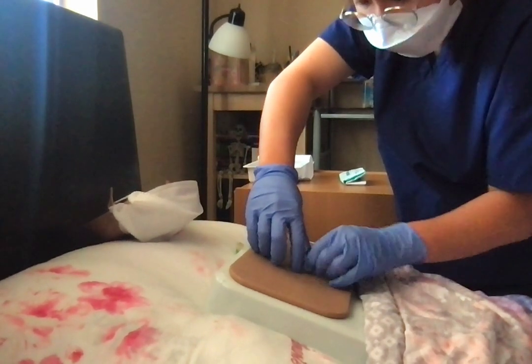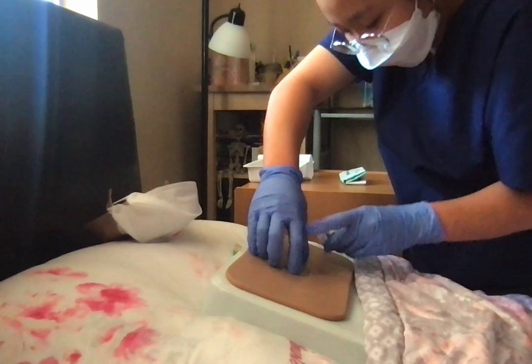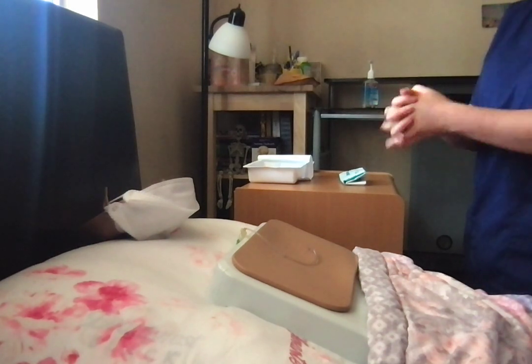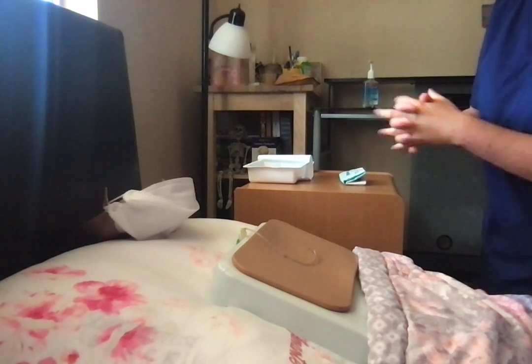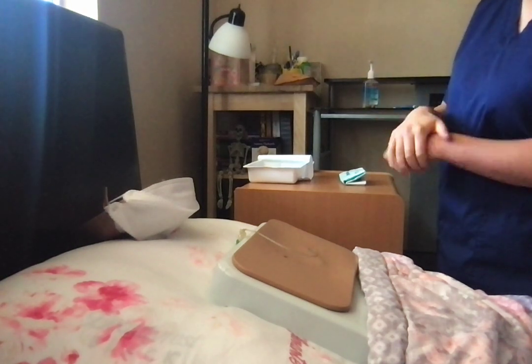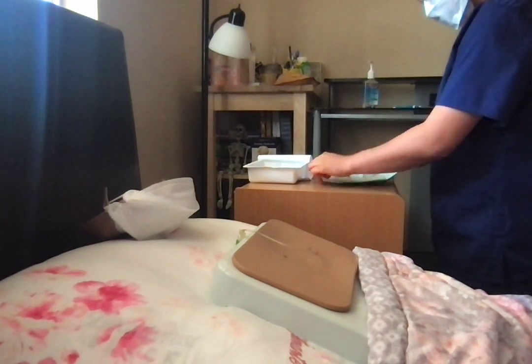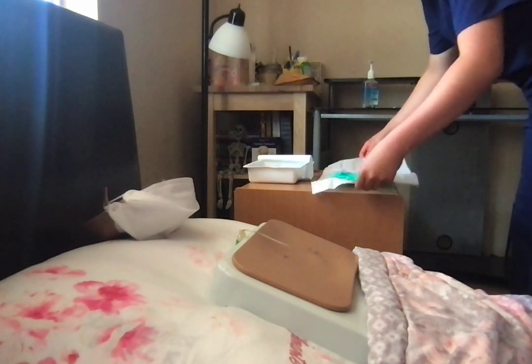Are you feeling any pain or discomfort? No? Good. I have removed the old dressing. I'll remove my gloves and perform hand hygiene. Looking at the skin, I can see it does not look red or inflamed — I don't see any signs of infection. The tubing does not have any cracks or leaks, it is 25 centimeters long as previously documented, and is located in the left subclavian vein. Mr. Jones, are you feeling any pain? No pain — excellent. Now I'll prepare my sterile gloves, making sure not to touch beyond the one-inch border.